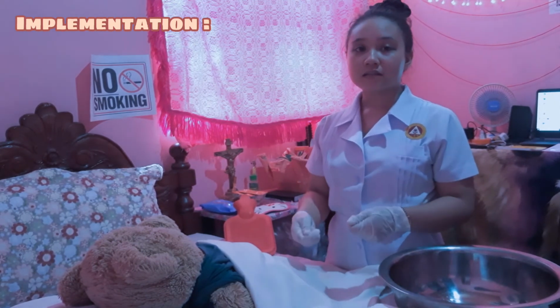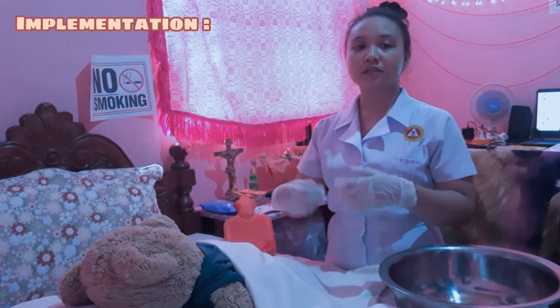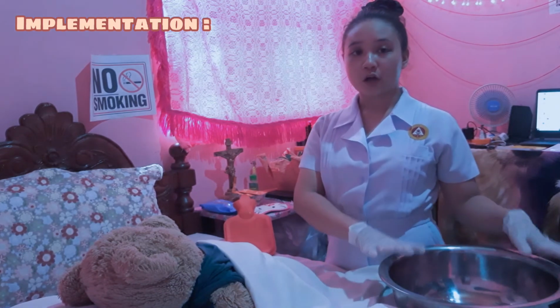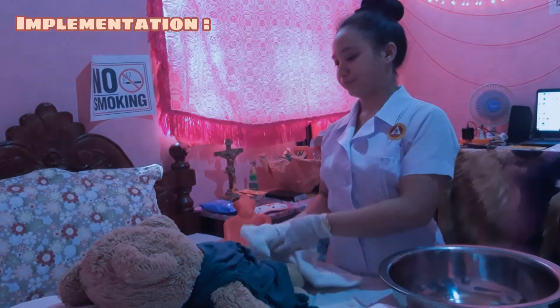Assist your client to a sitting position on a bedpan or a commode or on the toilet. So, sir, let me help you.